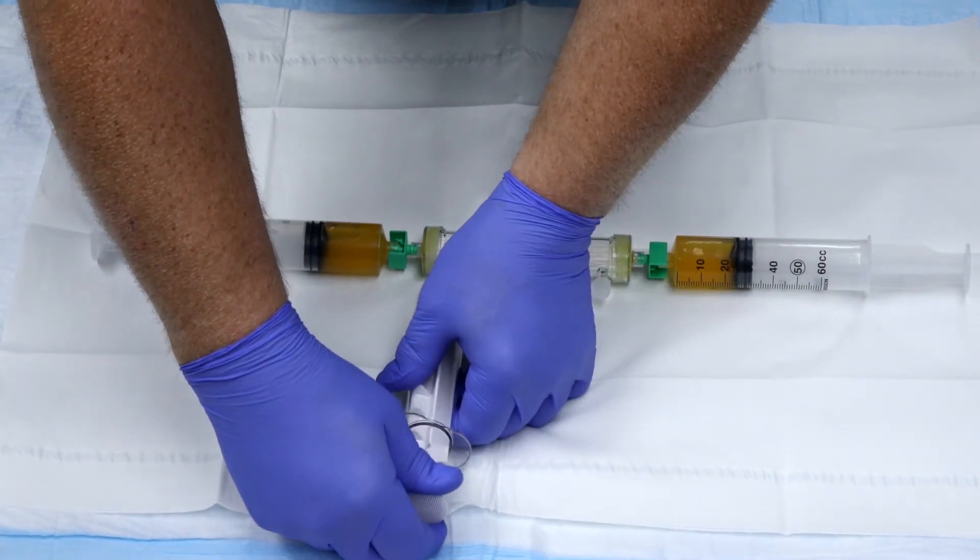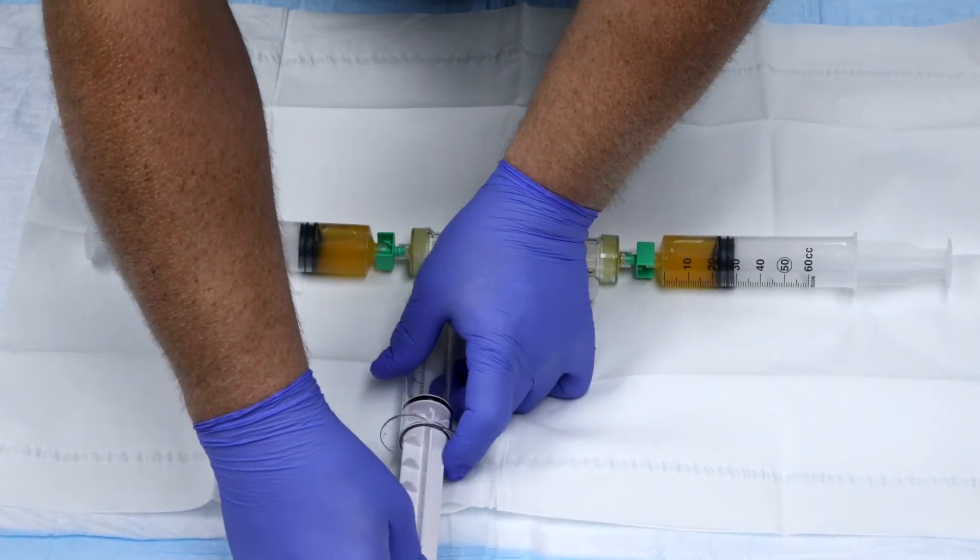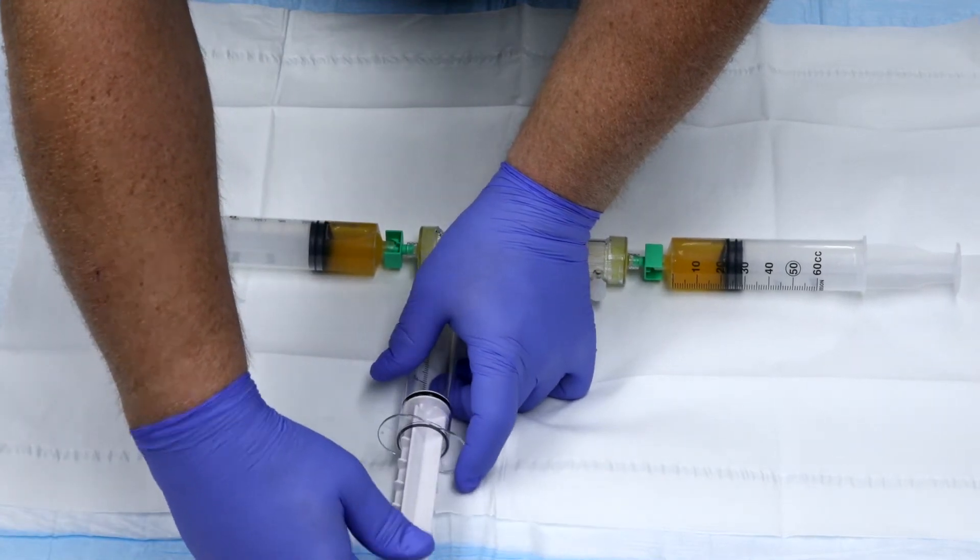Pull back on the vacuum syringe and lock in place. Ensure all ports are secure with no air entering the system.